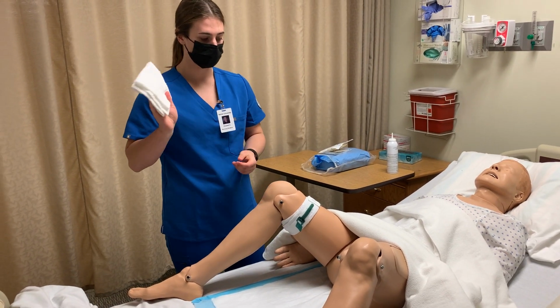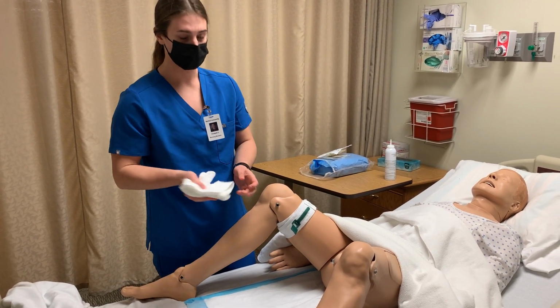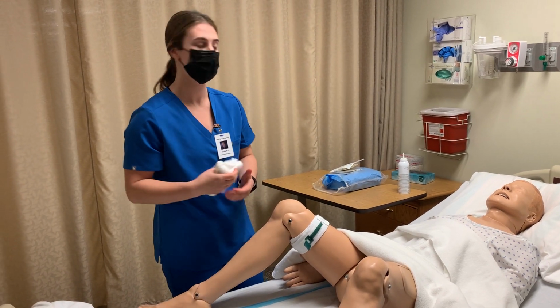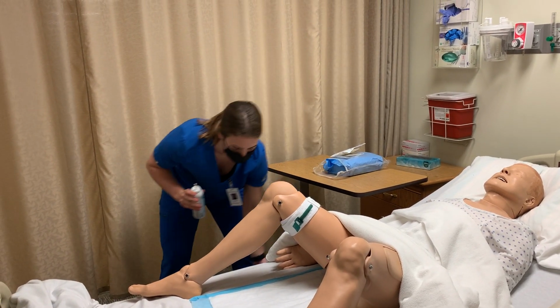So we would use a clean washcloth and warm water and skin cleanser, and then we would cleanse from the top of the perineum to the bottom, and use a new corner each time that we cleansed. And we would make sure that's nice and clean and dry before we moved on. So I'm going to go ahead and set up my workspace and perform hand hygiene again.